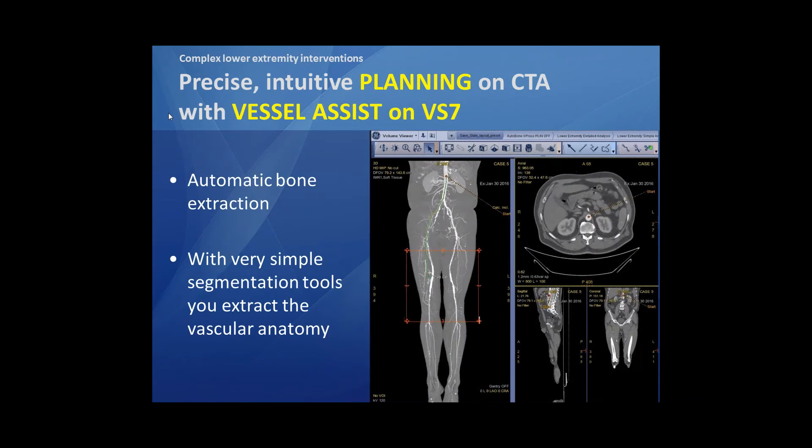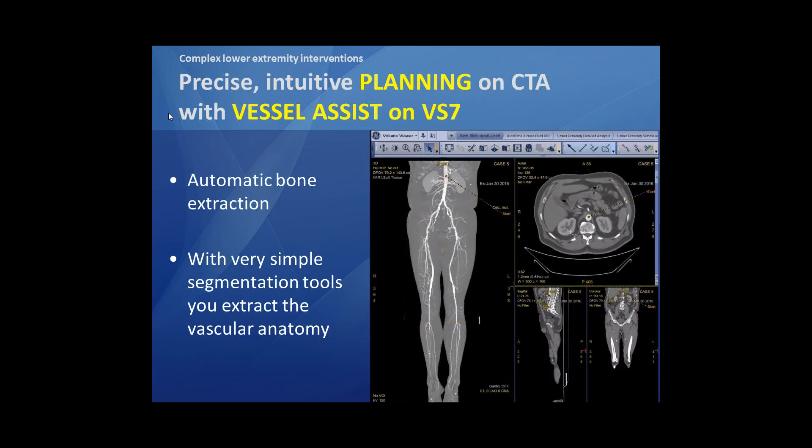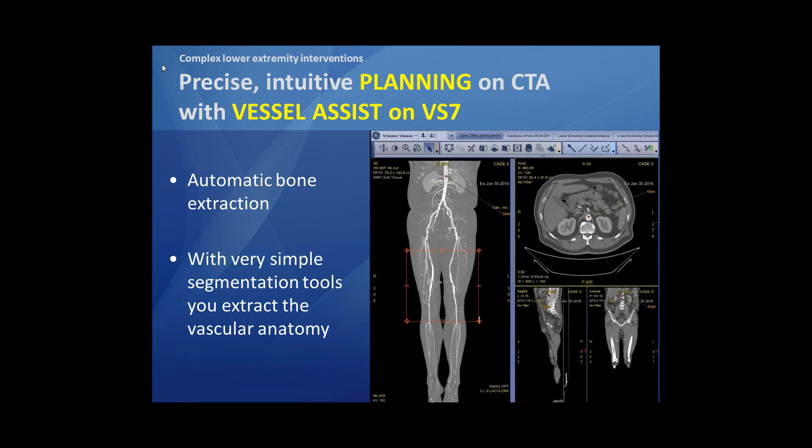We use nowadays the Vessel Assist on the VS7 of our workstation of the Discovery just to prepare our case. We create sub-volumes. As you can see here, it's almost in a very easy and intuitive way — I'm a vascular surgeon, not a radiologist, so in the beginning I was not comfortable with these automatic bone extractions and so on. But this system is really intuitive and makes it easy, in a couple of minutes, to do the preparation work. With very simple segmentation tools you can extract the whole vascular anatomy as you can see in the movie.